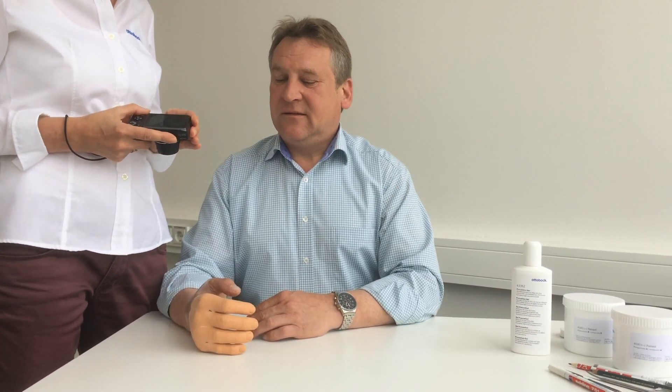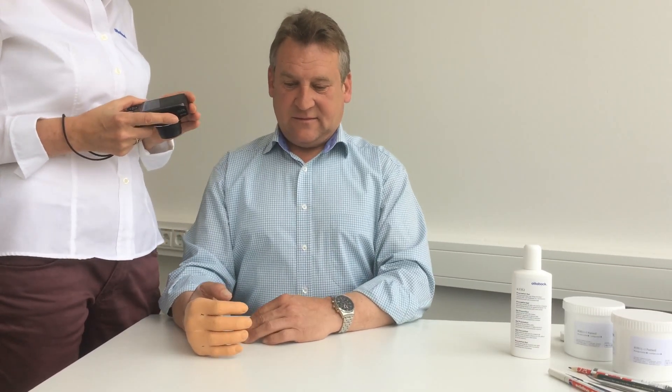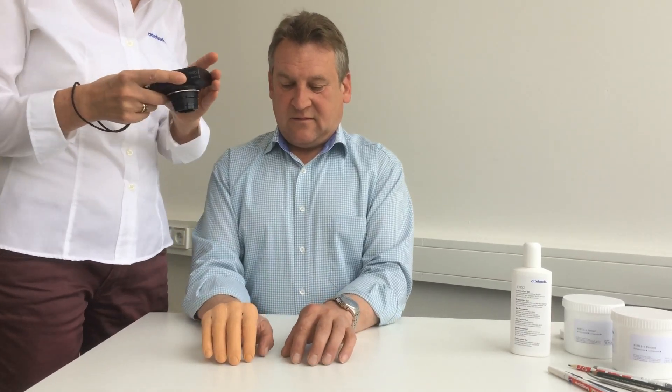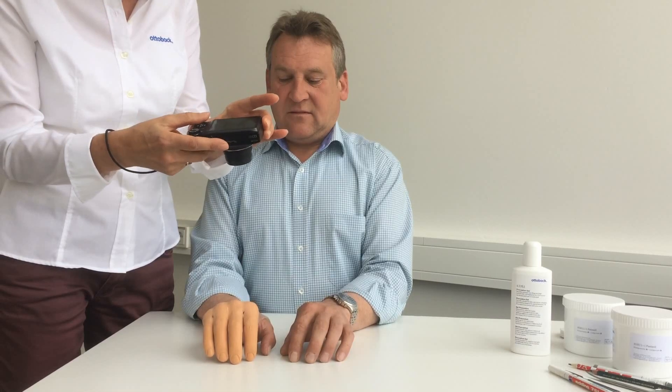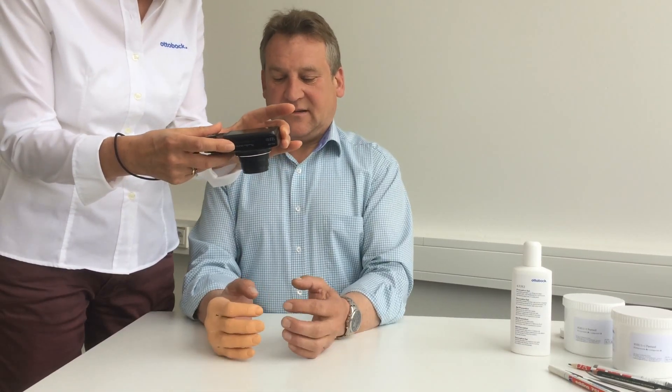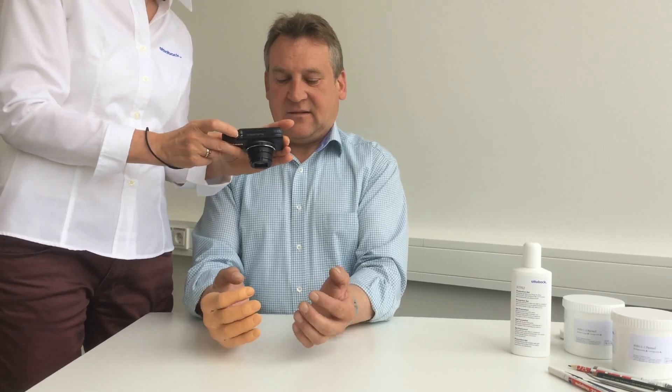Finally, I take pictures of both hands wearing the trial prosthesis. Please have the user sit up straight, with their shoulders relaxed and both elbows resting on the table and positioned at the same height. Please take pictures from the dorsal side, in the functional position, and from the palmar side with both hands similarly flexed.